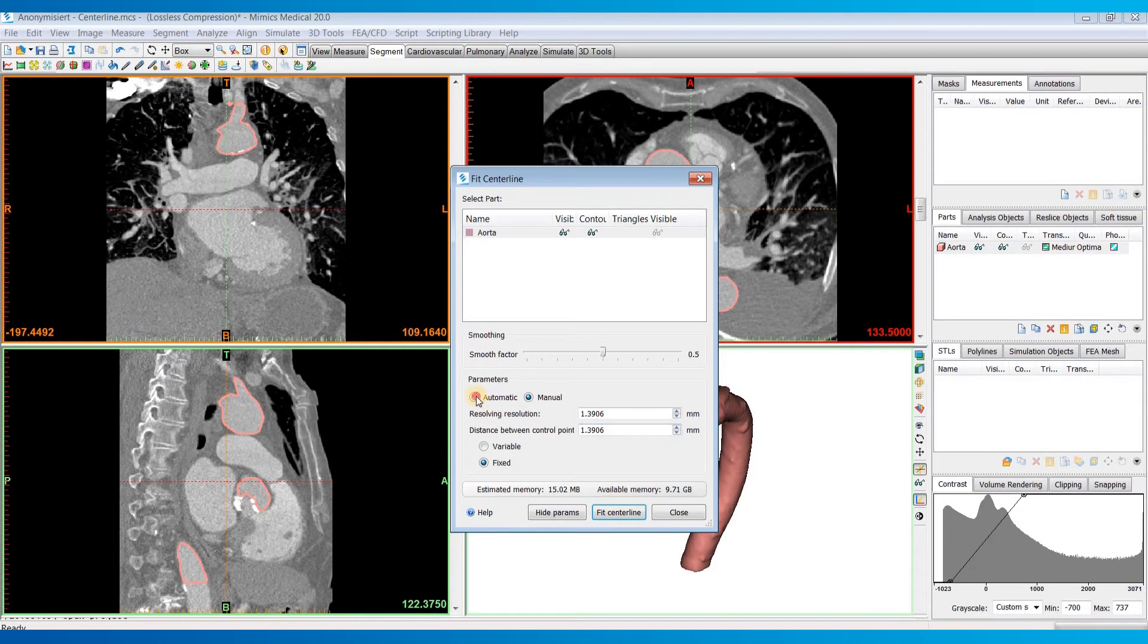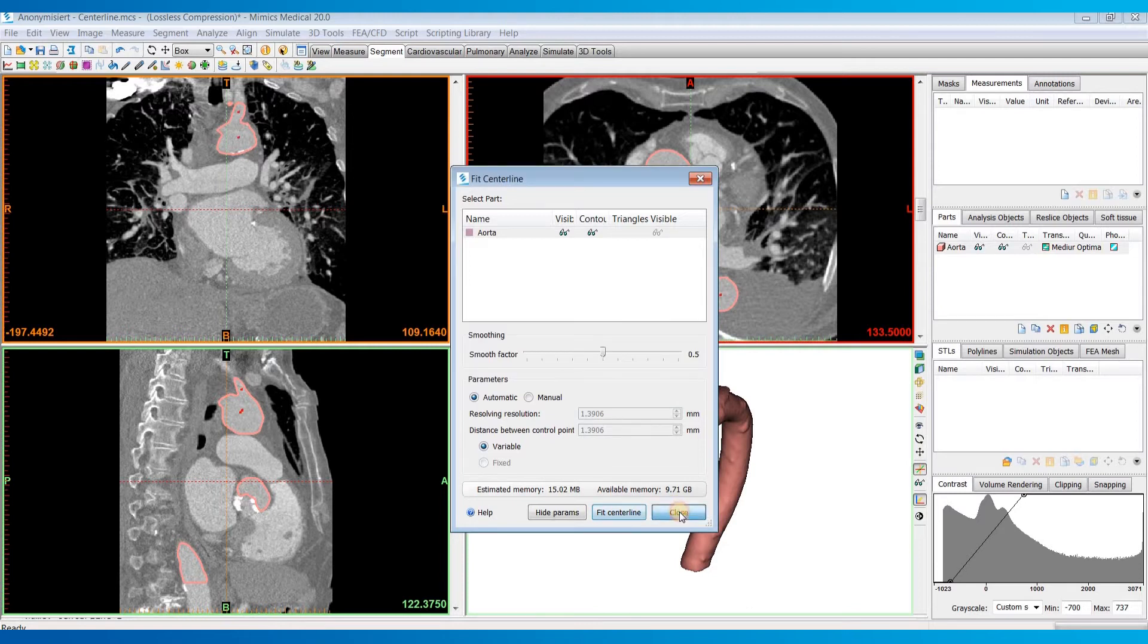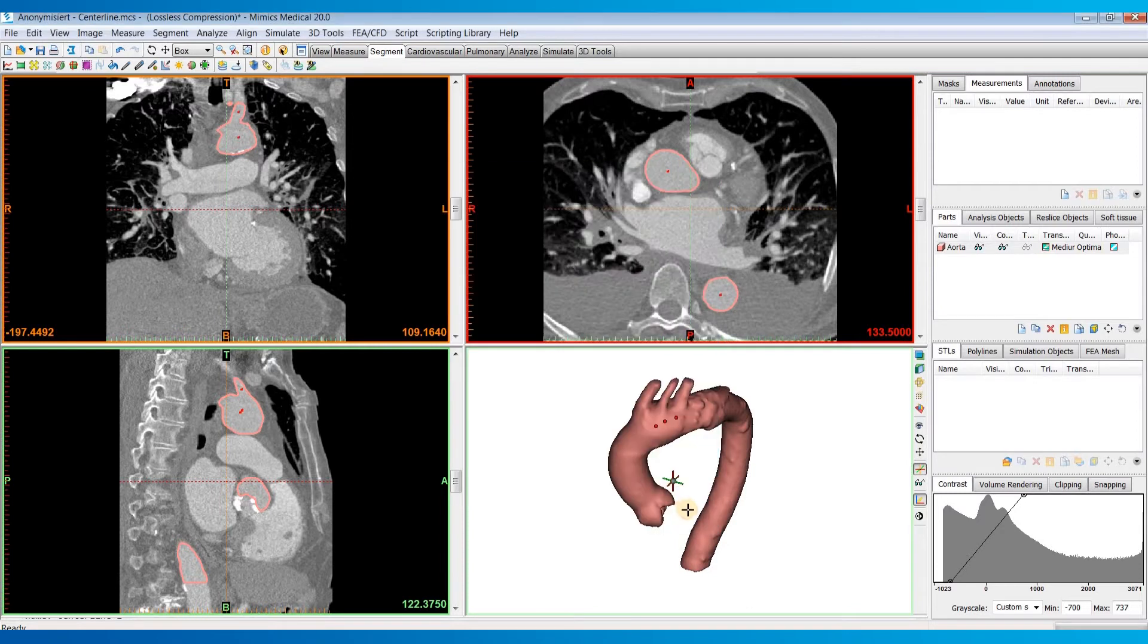So once the parameters are set, you can click Fit Center Line, and then it will calculate, and you can close out of the tool.